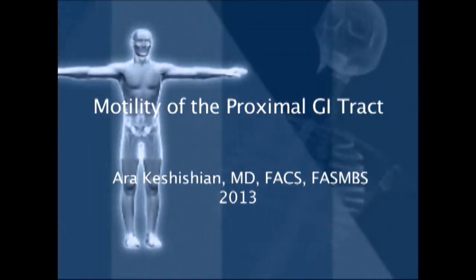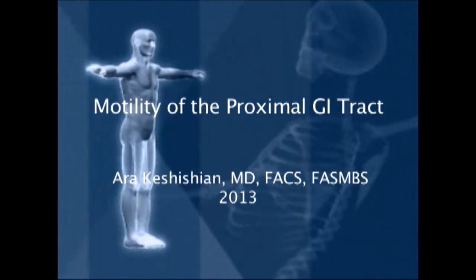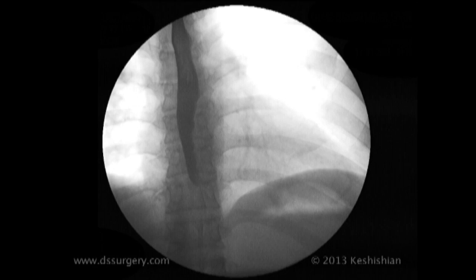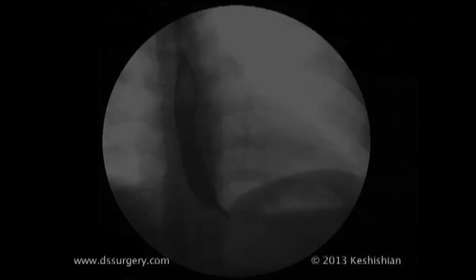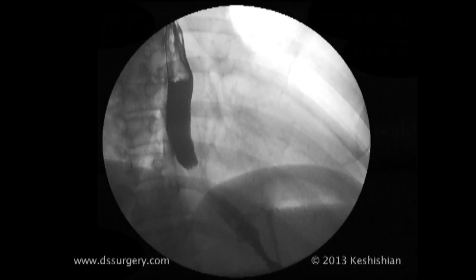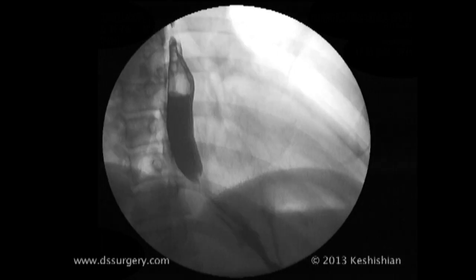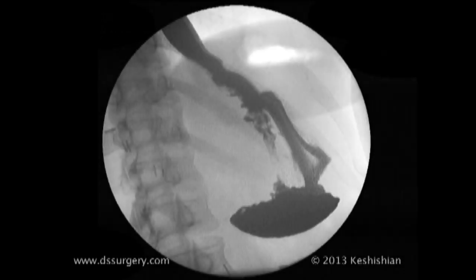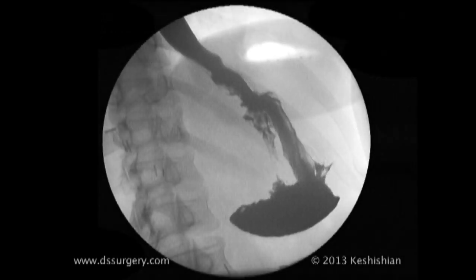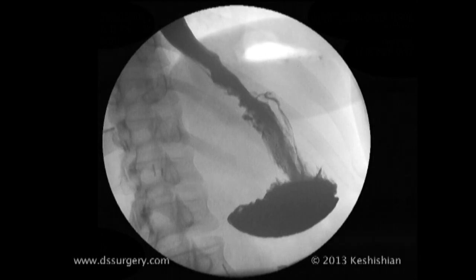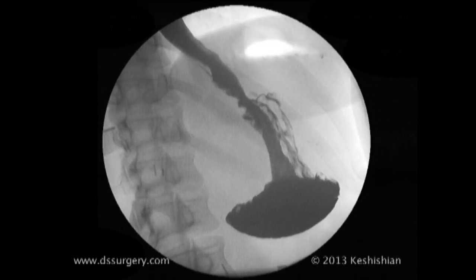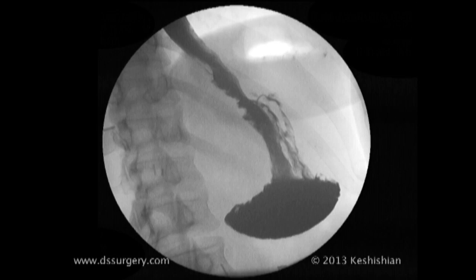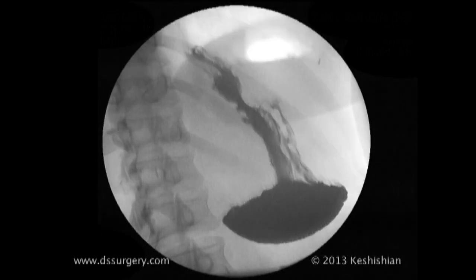Hello, my name is Ara Kashishian, and we're going to review a short segment of an upper GI series. This is a study where the contrast is swallowed by the patient under x-ray, and the contrast is observed as it travels through the esophagus into the stomach. The study can delineate any ulcers or reflux.